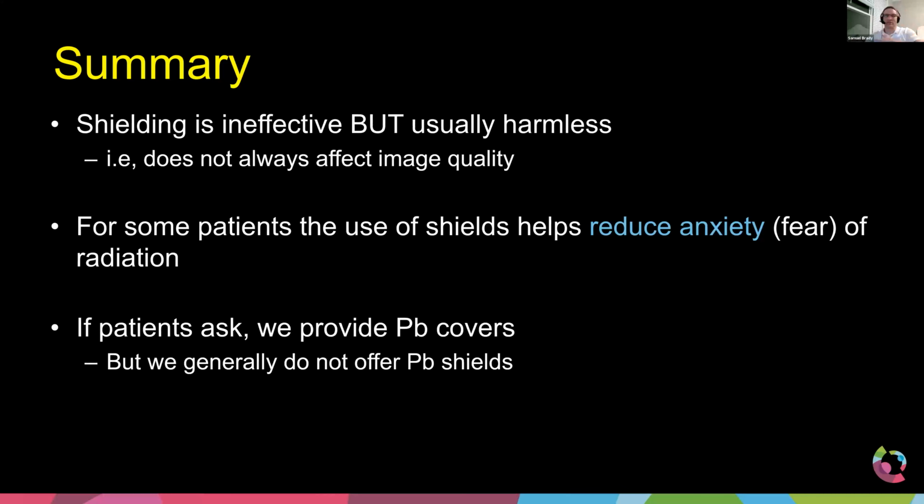If the shield is in place, so we've got a bismuth breast shield in place, and we're doing a chest CT, every time the CT scanner goes across anterior to those breasts underneath that shield, they're getting very, very little radiation. That is a fact. That is true. But when it spins around and shoots up through the body, guess what? You're exposing the breasts because you don't have shields back here.